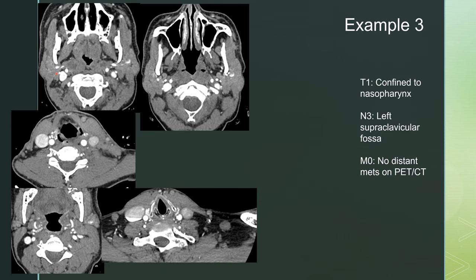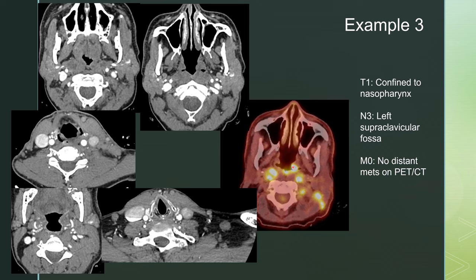Example three: on the original CT scan, you can see partially necrotic or cystic retropharyngeal lymph nodes on the right and left. Going more inferiorly on the CT, there is lymphadenopathy throughout the left level 2, 3, 4, and 5 nodal chains, including the supraclavicular area. Although the nasopharynx was the prime suspect given the retropharyngeal lymphadenopathy, we could not clearly see a mass on CT — the left torus tubarius looks slightly more bulbous than the right, but nothing obviously mass-like. However, the PET scan showed that area of subtle nodularity was the true culprit.